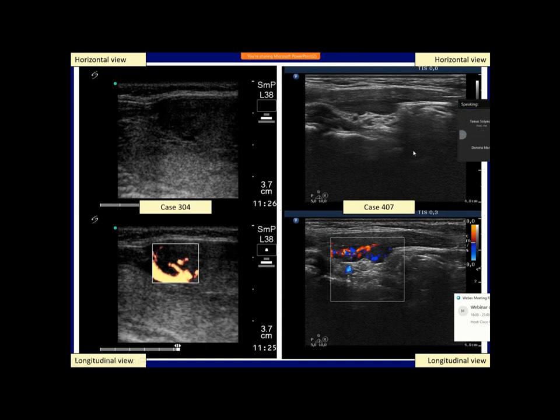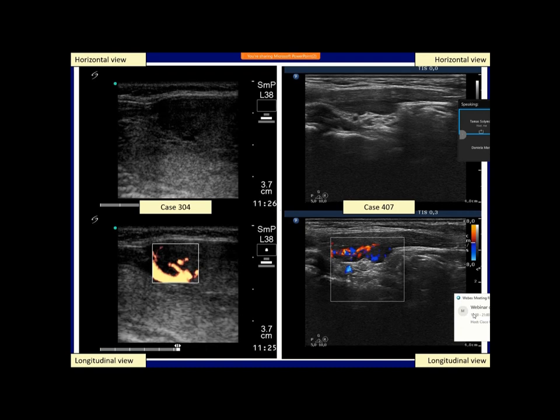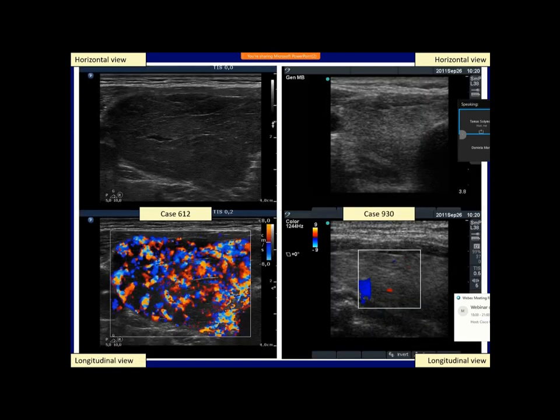In the left case, there is a hypoechoic mass ventral to the thyroid lobe. It was not evident on grayscale mode whether this is a thickening of the muscle fiber or another structure. Color Doppler proved that this cannot be muscle fiber, and fine needle aspiration cytology disclosed papillary cancer from this region. The right case presents a similar situation: the origin of a deeply hypoechoic linear mass between the muscle fiber and the thyroid was in question. The increased vascularity excluded the possibility of muscle fiber, and the lesion proved to be a parathyroid adenoma.